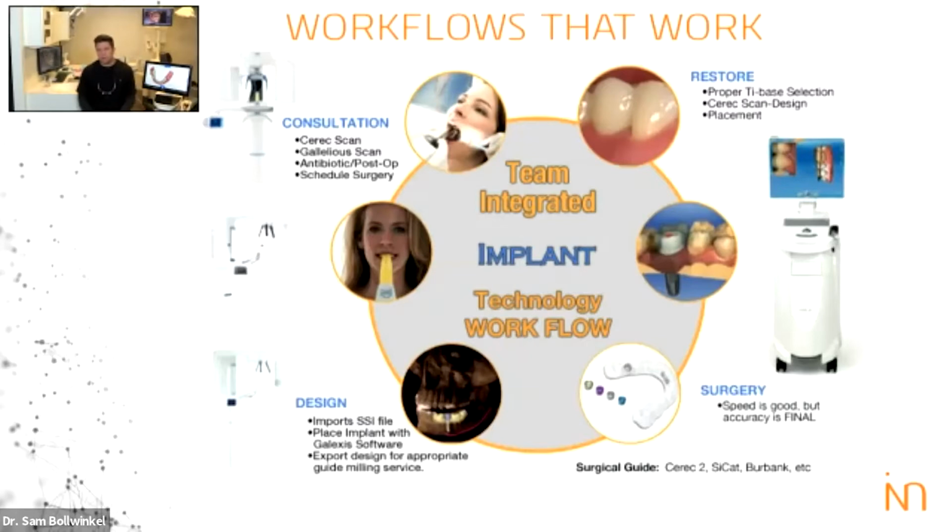The Dentsply Sirona workflow is just amazing. As you look at this screen, what we're going to be talking about is having a CAD/CAM system that talks to a cone beam system that then talks back to a CAD/CAM system that allows me then to CNC mill a CEREC guide. The same equipment that I use to do crown and bridge every day is now expanded in function, allowing me to bring in implants and provide an implant solution to my patients in a predictable and efficient manner. And as we're going to demonstrate live today, a 10-minute implant. So, what could go wrong?